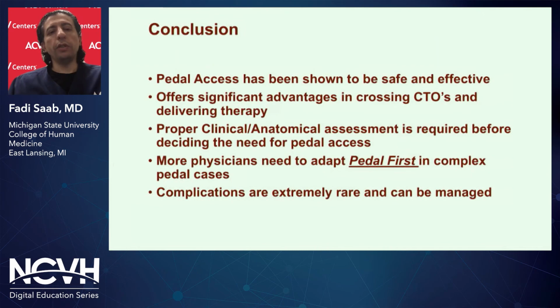So, in conclusion, pedal access has been shown to be safe and effective. It offers significant advantages in crossing CTOs and delivering therapy. Proper clinical and anatomical assessment is required before deciding the need for pedal access, and more physicians need to adopt a pedal-first approach in complex CTO cases and peripheral cases. And complications are extremely rare and can be managed whenever they happen.